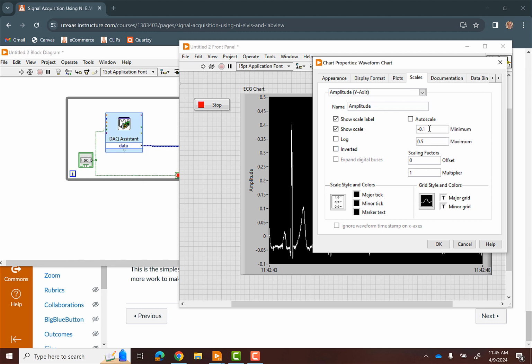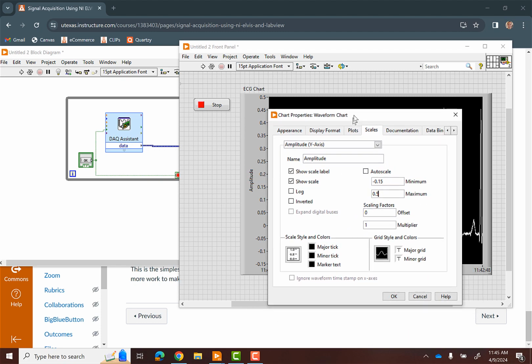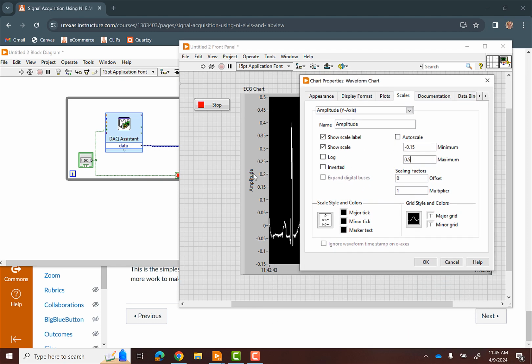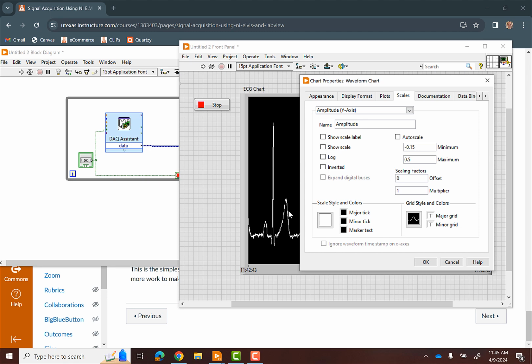And so rather than auto scale, I think I'm going to scale this. I'll give it a little more room on the bottom. 0.5 at the top is probably pretty good. And I can look at my data if I want any more. But the other thing is, do I really want that word amplitude right there? So I'm going to get rid of that scale label. I don't need that. And honestly, do I really need the numbers, right? This is an ECG. It doesn't really matter what the numbers are. So I'd rather make more room for my graph, right?